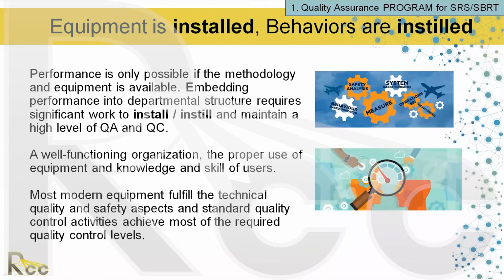So equipment is installed. Having the equipment is important, but the behavior is something that takes time to develop. And that's really essential because, like I said before, it's not the equipment that often fails. In fact, it's a breakdown in communication, or it's a procedure that fails. So ensuring that the behaviors are fostered, having a positive safety culture where people are safe to speak up and question, is really important.